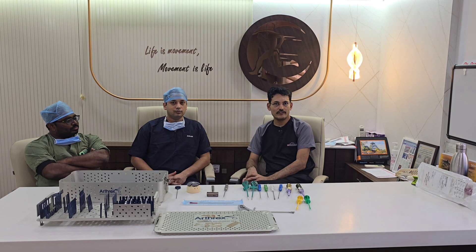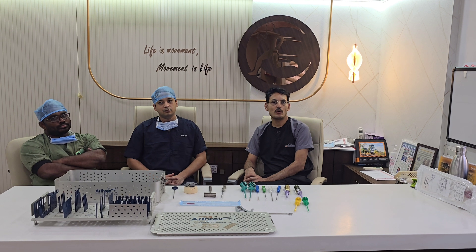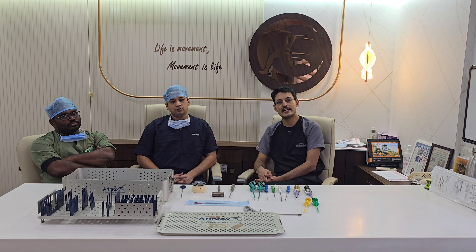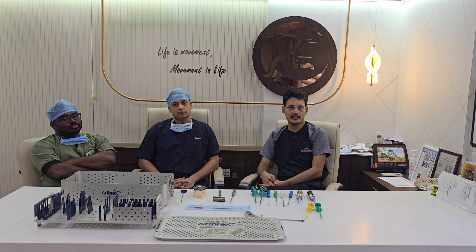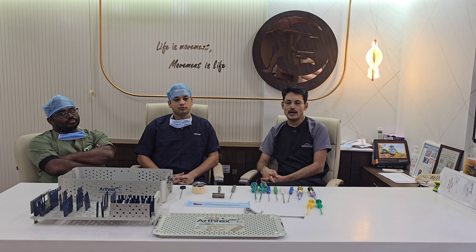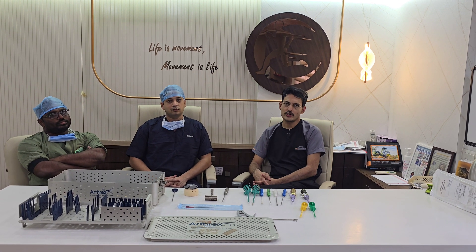Welcome to the rotator cuff repair workshop. In this workshop we will be demonstrating rotator cuff surgeries from the Arthrex instrumental set. Arthrex has a very wide portfolio regarding rotator cuff repair, and we will be demonstrating all the anchor options and instrumentation options available to do these surgeries.